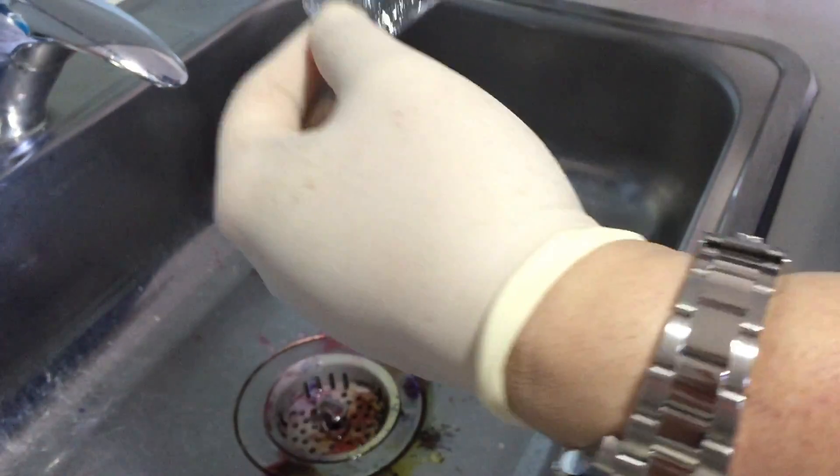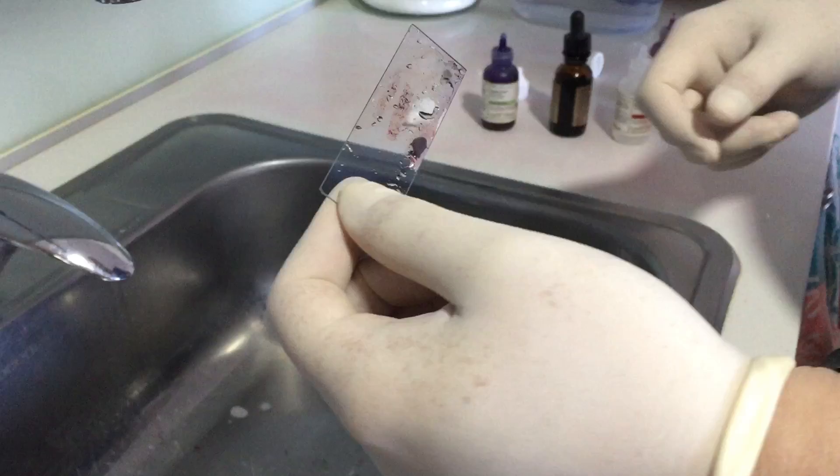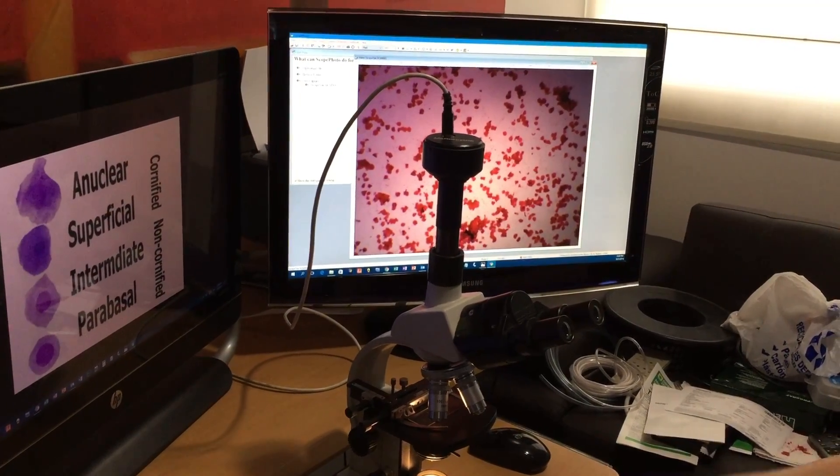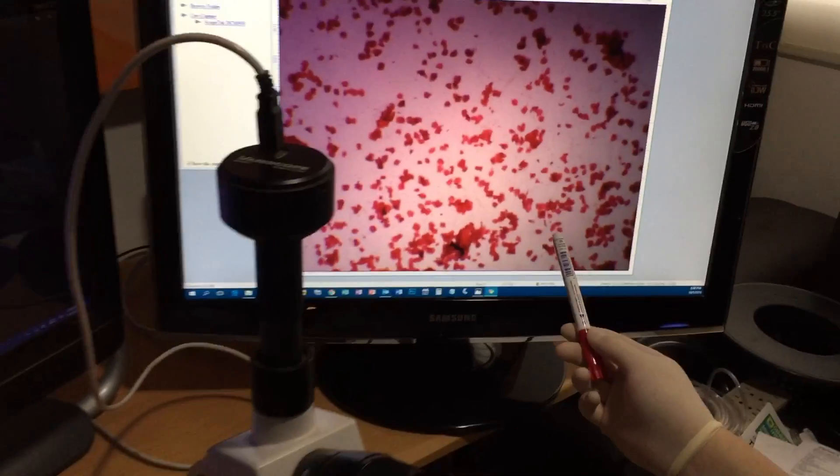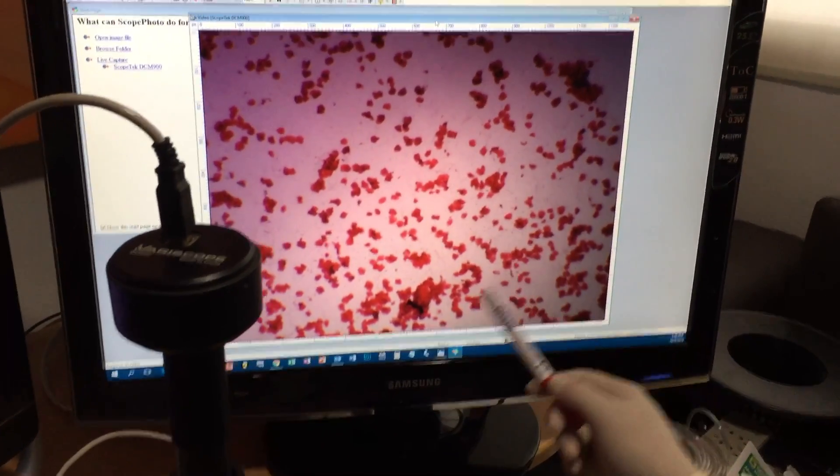Alright, so we have the slide ready. Now let's go look at the third slide. Here we can see that almost all the cells are cornified.